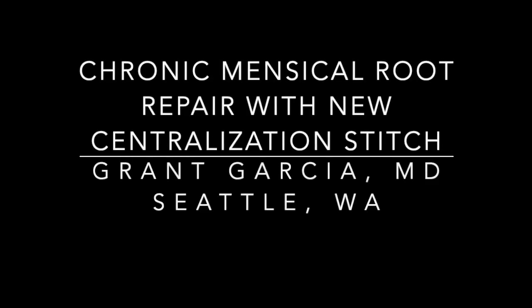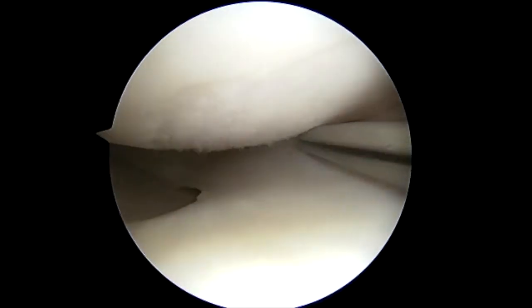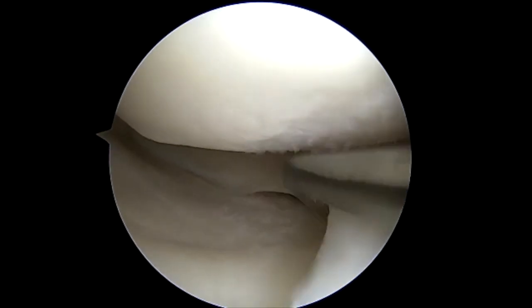Today we're going to demonstrate our technique for chronic medial meniscus repair with a new centralization stitch. There's been some research recently on these chronic meniscus tears and ways to further improve our outcomes and reduce meniscal extrusion.